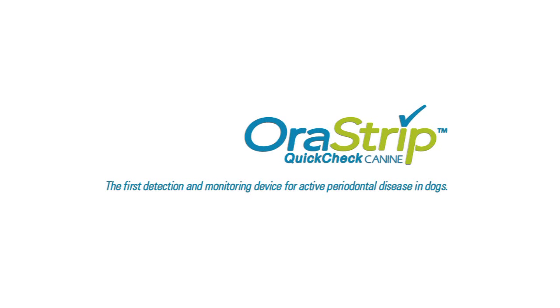Introducing OraStrip Quick Check, a simple, quick, and accurate test strip which detects and monitors periodontal disease activity in dogs by measuring the extent of periodontal infection.